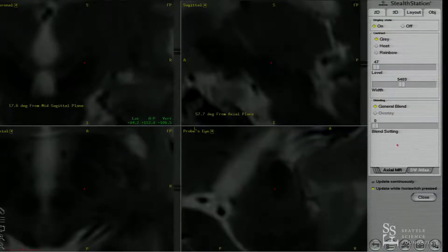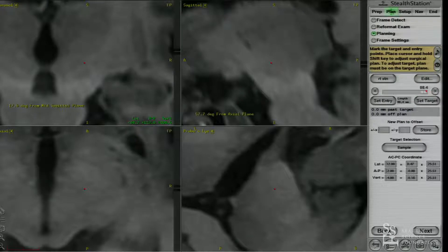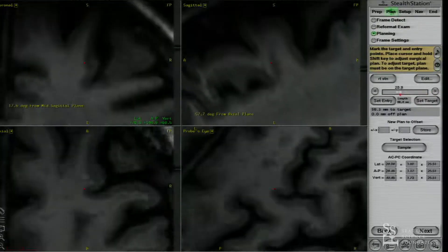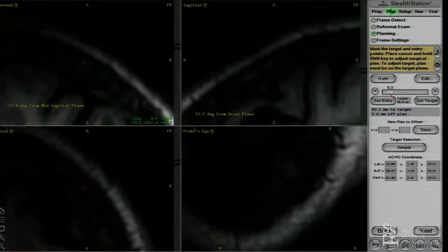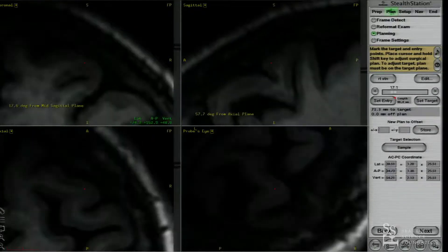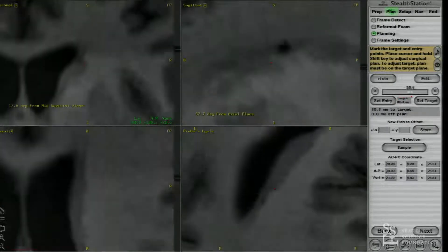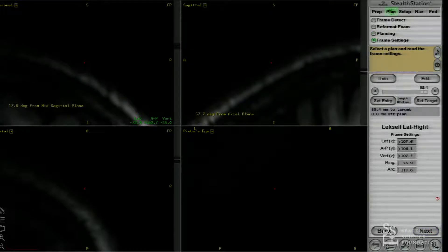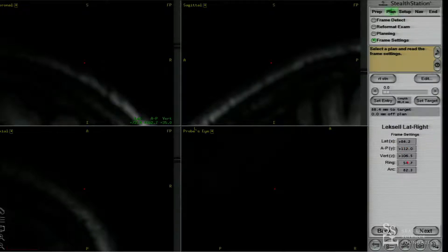Looking back at our T1, making sure we have a good, safe trajectory that avoids the ventricle — try to stay off the ventricle by about four millimeters. And basically, once we get in, we hit the gyrus and we stay in. So once you pick your target, which is XYZ, and you pick your trajectory, which is your entry point — defined by the ring and arc — we're all set with our coordinates. These are our coordinates for the right side. So XYZ defines the target, and then ring and arc define the entry point.